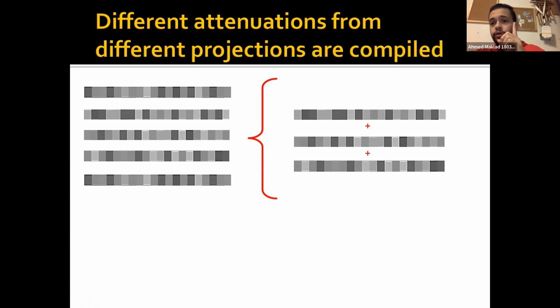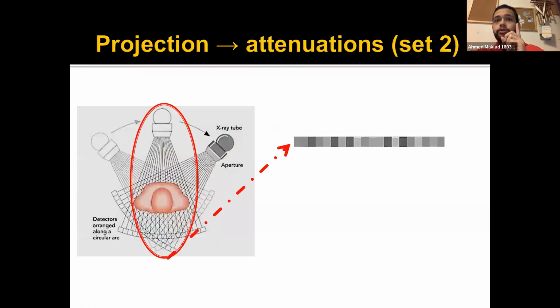There's one X-ray tube and you have multiple detectors. So if you go back here, can you see those small cubes? Each one is a detector, all right? So you have one X-ray tube, but multiple detectors, all right?